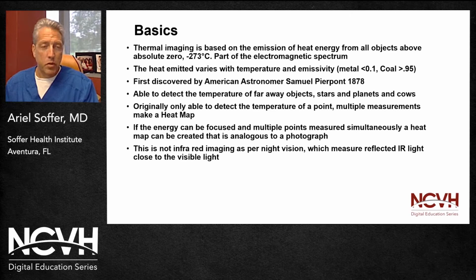Let me go over some rudimentary basics. This is never the most fun part of any talk, so we're going to build positively from here, but I will tell you a few things about thermal imaging. It's based on the emission of heat energy that really emanates from all objects above absolute zero, which is minus 273 degrees. It is part of the electromagnetic spectrum, which I'm going to show you in the next slide, which gets a little more colorful.